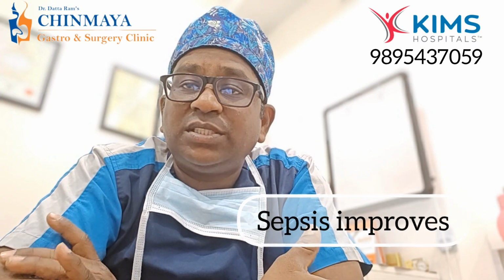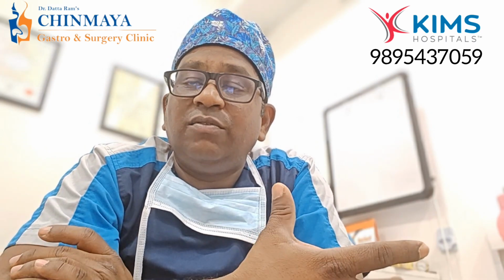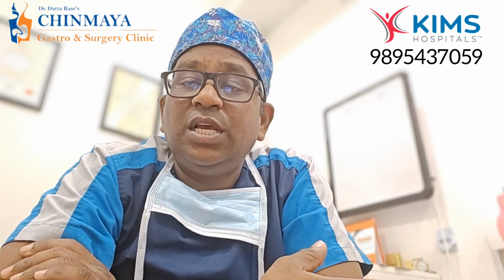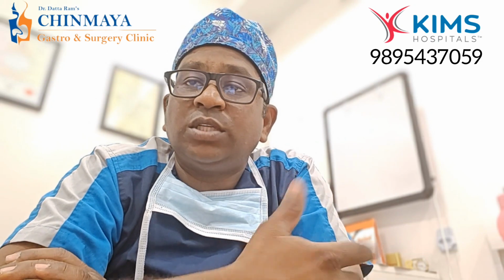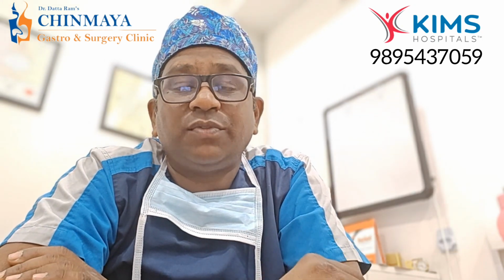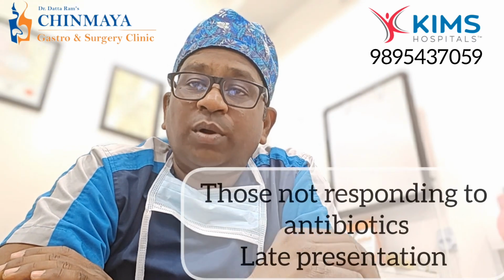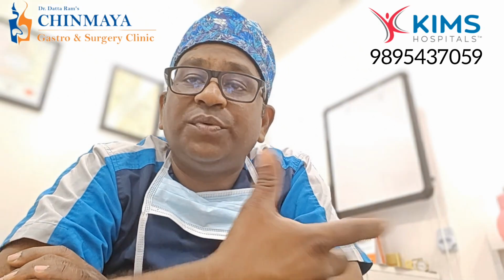In unfit patients, surgery is very risky. So when we do this procedure, we will be able to tide over the crisis. Once we do this procedure, most of the patients will be able to come out of the ICU because the sepsis will resolve, the organ failure improves, and the urine output starts coming up. So this is a life-saving procedure, especially in those patients who are very sick and who have infection of the gallbladder. This procedure is also done in patients who are having protracted illness. They come late, are not candidates for surgery, and are not improving with the antibiotics.